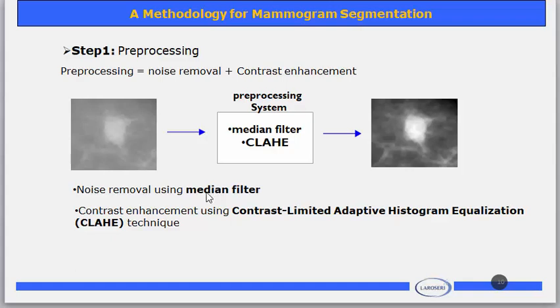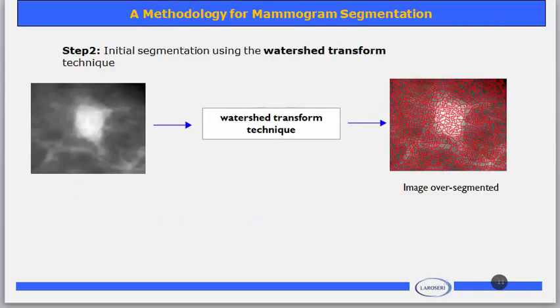To enhance the contrast of mammograms, we propose the contrast-limited adaptive histogram equalization technique. This technique is very practical in image enhancement thanks to its simplicity and great performance with almost all sorts of images compared to other methods.